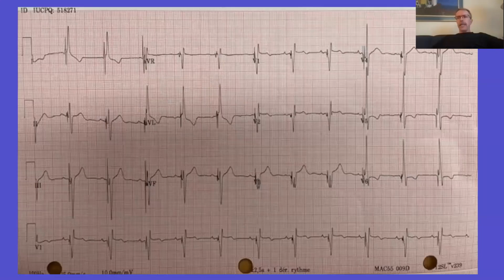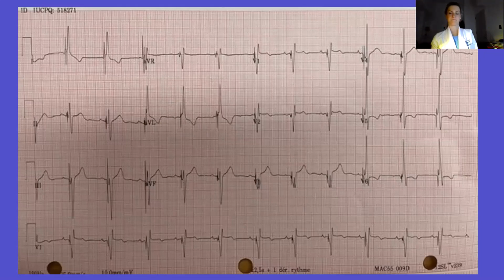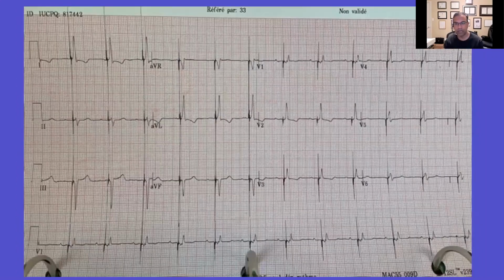But if you want to see latency, don't you often have to pace at very low outputs to lose some of that septal capture? Yep, typically selective pacing essentially. Exactly, but that all looked very selective to me. I can't imagine he was pacing at a very high output there.